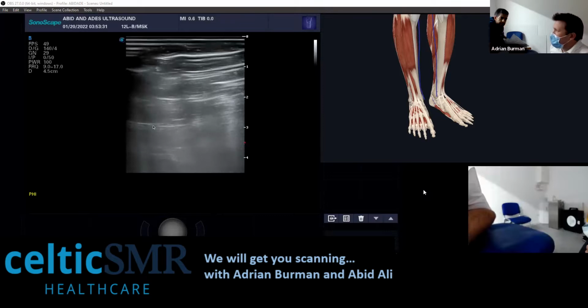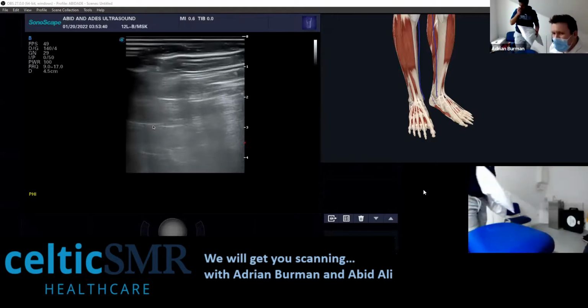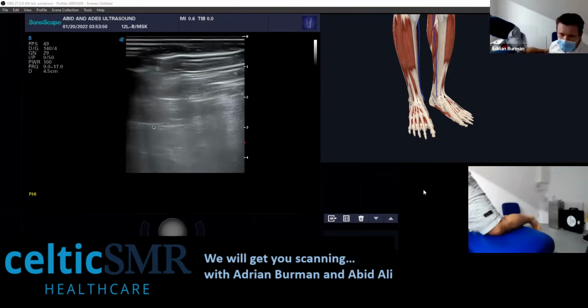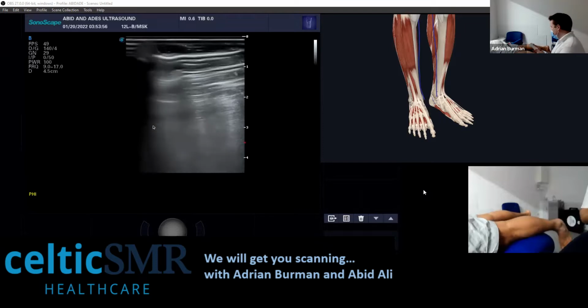Well, one, you have to be really careful with soleus ultrasound. MRI is the best. I mean, you can look at soleus if you've had a lot of experience and practice with it, but it is quite difficult. I think we can only pick up like 30% of soleus tears and things like that on ultrasound. But essentially, scarring.